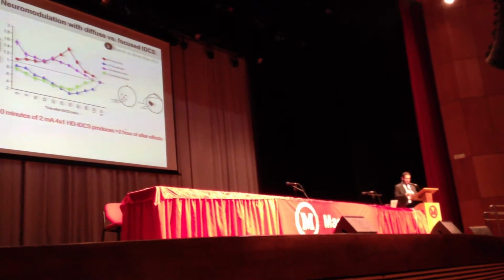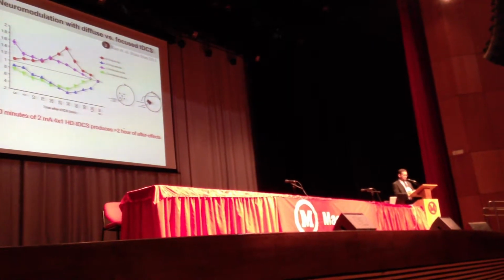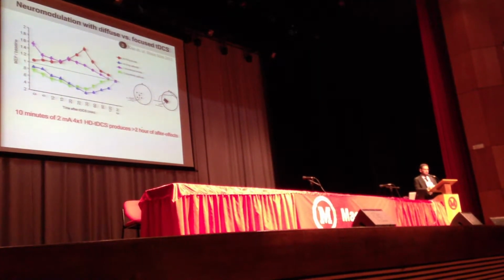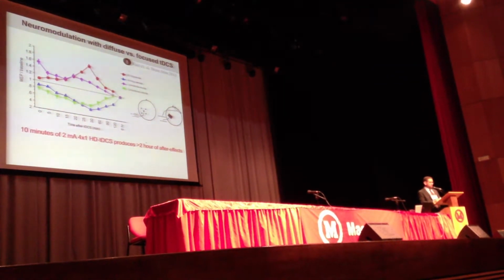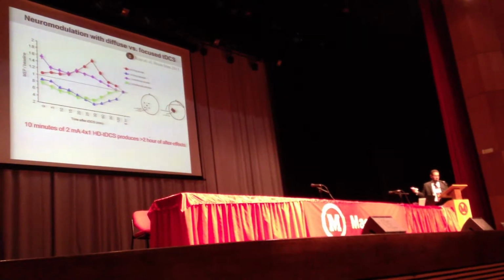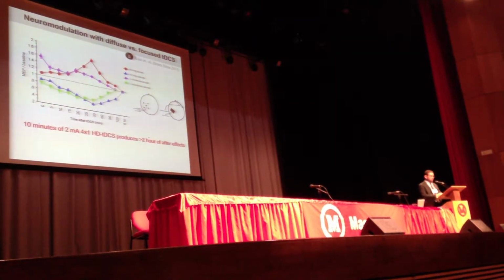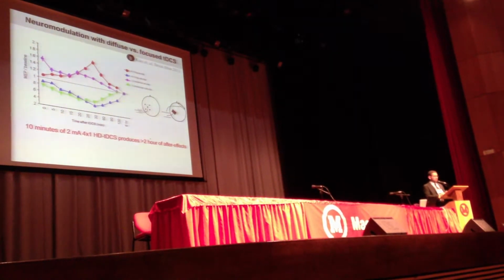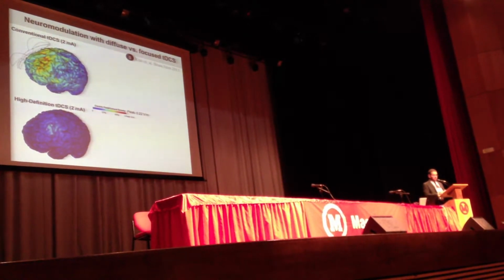And so this means that 10 minutes of stimulation with a 4x1 montage could potentially produce over 2 hours of modulation. Now, the TMS MEP marker is a gold standard in our field. It certainly has its limitations. For example, here, there was no change, but clearly something was not the same because stimulation had stopped and we saw an accumulation. But what this study showed, by a lab that has been leading the field for some time, is that with the 4x1 montage, current can be delivered to the region. And so a good question then is how much?